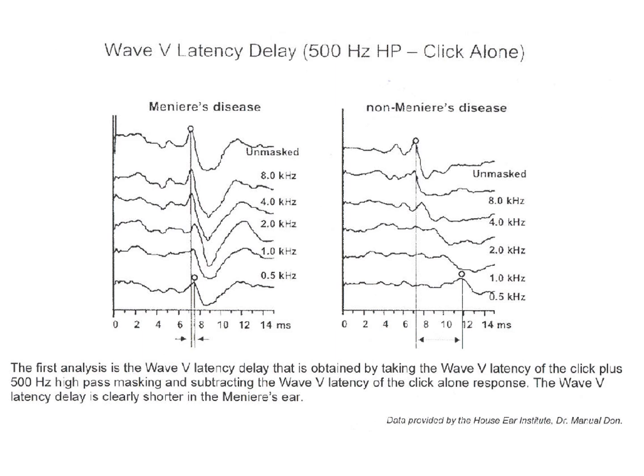This slide shows another figure that I copied from the literature. On the left-hand side shows a series of derived band ABR recordings in patients with Meniere's disease. So the top trace is the ABR waveform evoked by using clicks only. In clicks only, we mark the wave V here, and we draw a vertical line as a reference line.